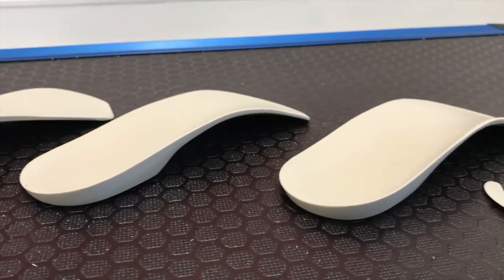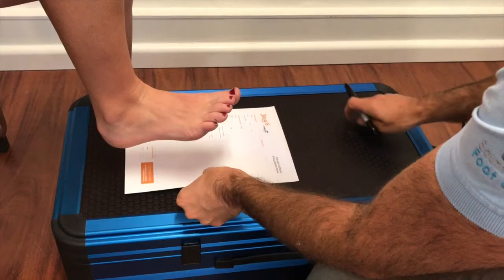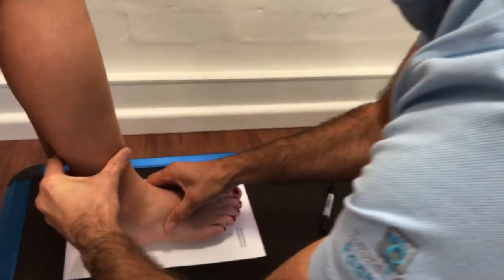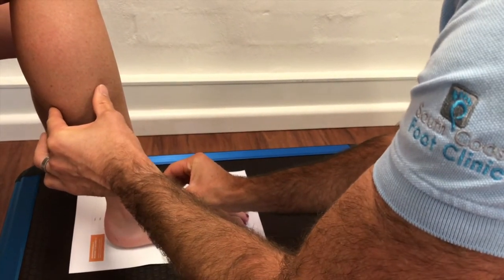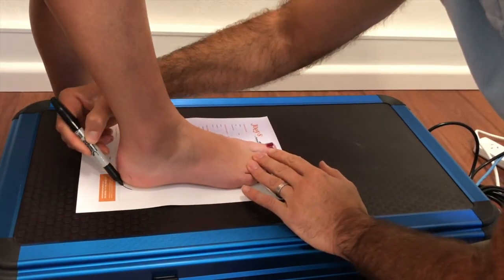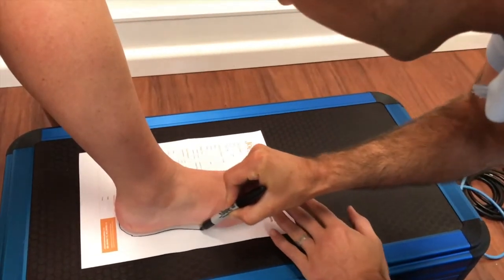The first step when prescribing a Joey orthotic is to obtain a tracing of the client's foot. To do this, place one of the client's feet on the tracing area, whilst ensuring the posterior aspect of the heel is forward of the bottom section of the tracing area. Place the subtalar joint in a neutral position, then trace the whole outside of the foot, but don't worry if the toes fall off the front edge of the paper, as only the MTPJs are needed for the lab to determine the appropriate Joey size.